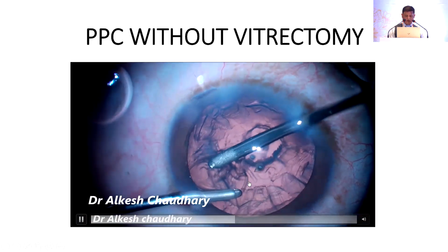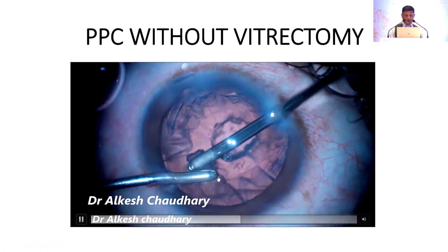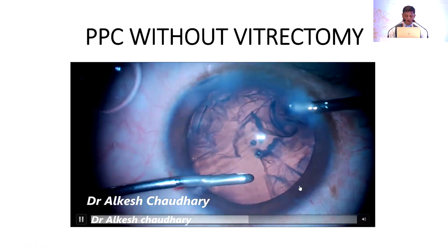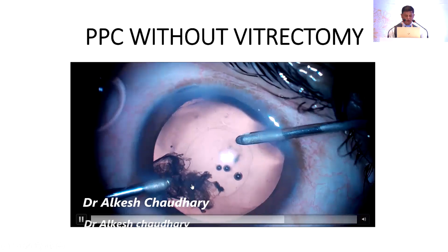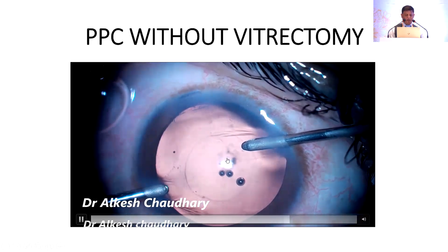This time I am using irrigation aspiration. Irrigation is always away, in the anterior chamber. I am not pushing irrigation behind in the capsular bag, just to avoid hydration of the vitreous. So changing hand again after injecting viscoelastic, you see the whole of the nucleus and epinucleus has been removed, but the defect remained the same, it didn't extend at all.